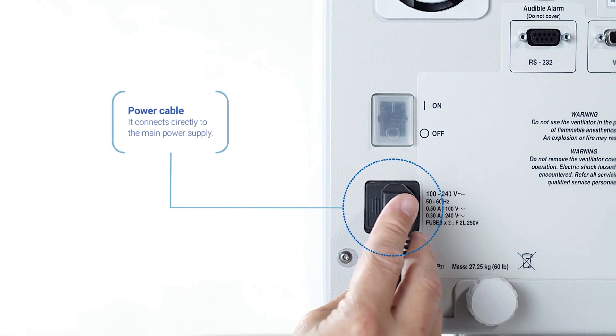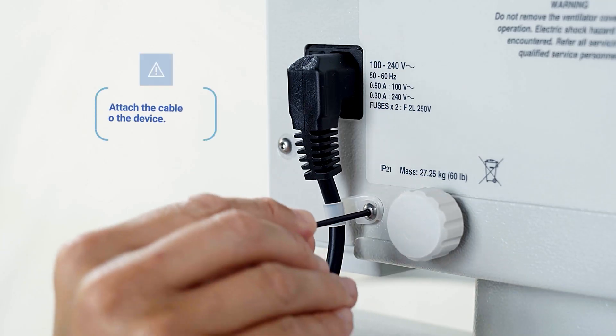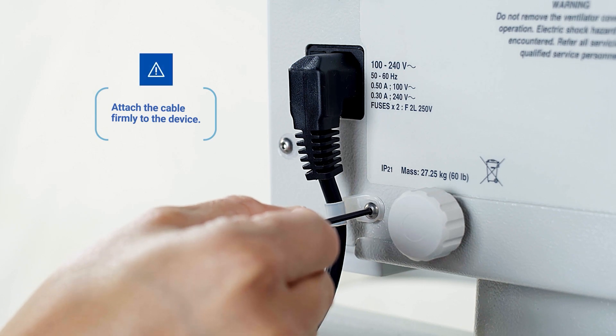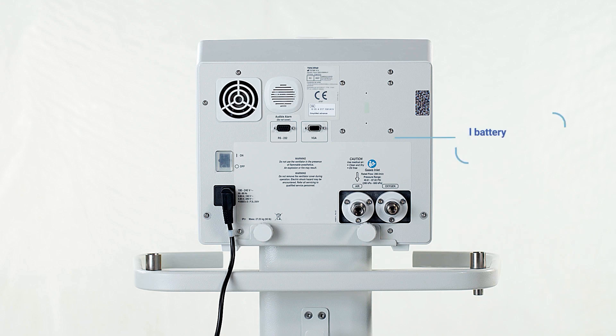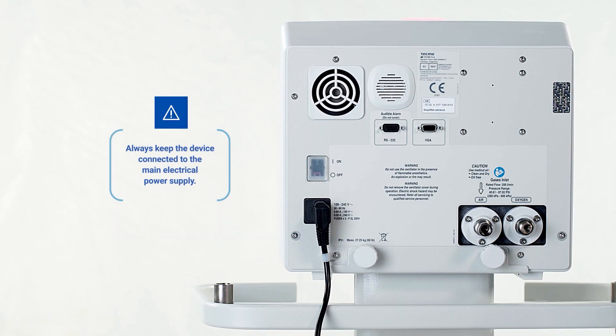A socket for plugging the power cable can be found on the left side. Connect the power cable directly to the main power supply of the building. It is important to fix the cable to the rear panel with the safety flange in order to prevent unexpected disconnections. The device has an internal battery with a 2.5-hour battery life in case the main power supply is interrupted. The device should always be connected to the main power supply of the building, even when not in use, to ensure that the battery is fully charged.